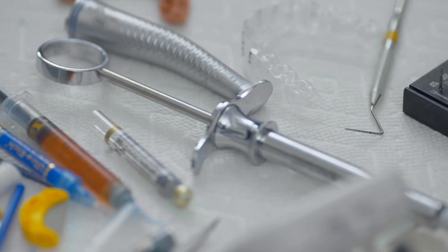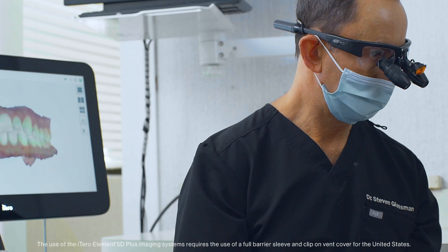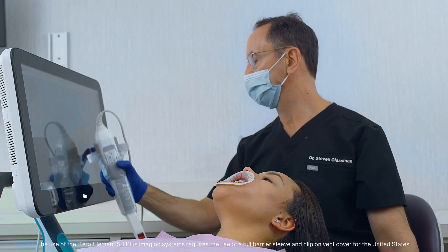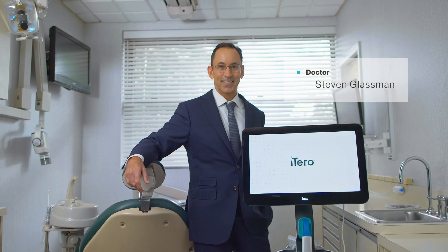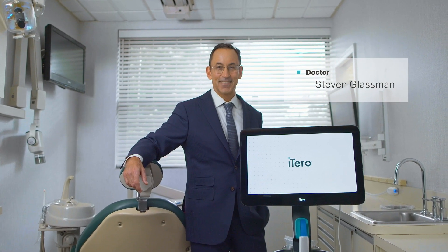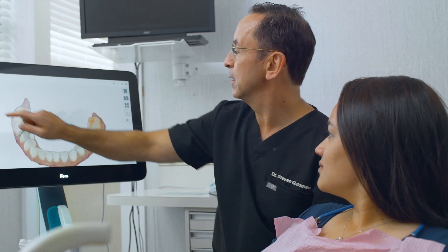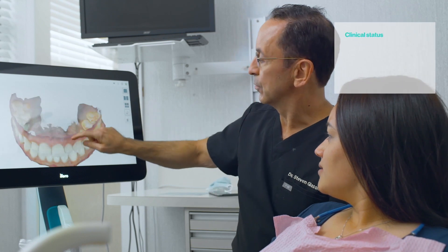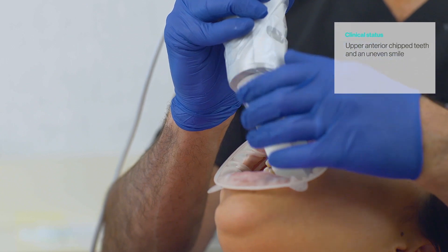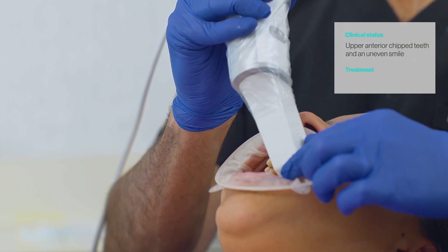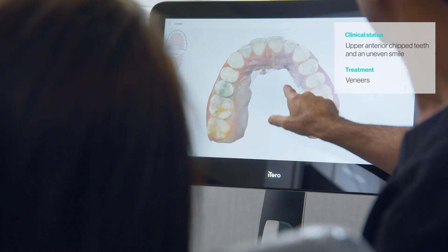With roots in restorative dentistry, iTero intraoral scanners are designed to streamline and enhance digital workflows like veneers. Dr. Steven Glassman will demonstrate just how intuitive the digital workflow for veneers can be. This patient came to see Dr. Glassman with the chief complaint of upper anterior chipped teeth and an uneven smile. After examination and diagnosis, the chosen treatment approach was eight minimally invasive veneers in order to create a symmetrical smile.